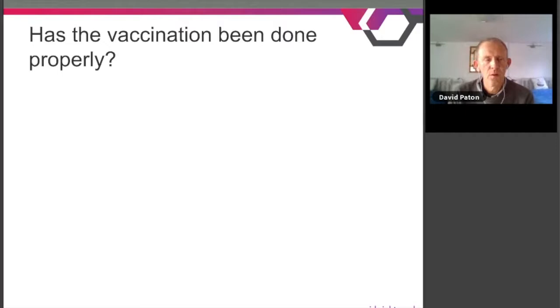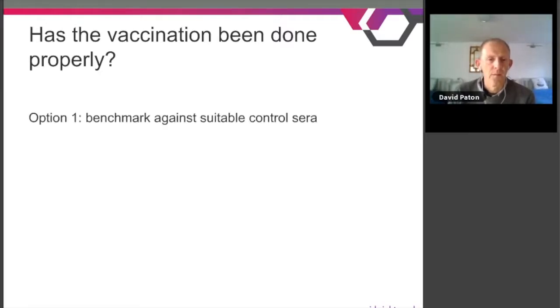Okay, so if we go with the first question that we said we would try to address from analyzing these sera, it is, has the vaccination been done properly? And the first option for this is to benchmark the results you get on testing the field sera against suitable control sera.